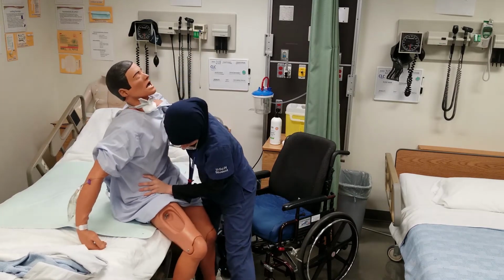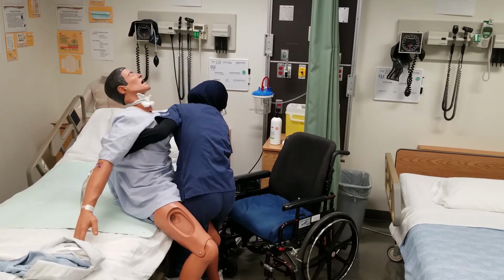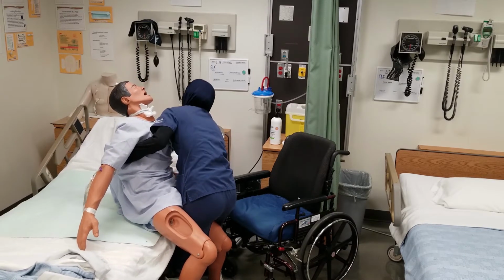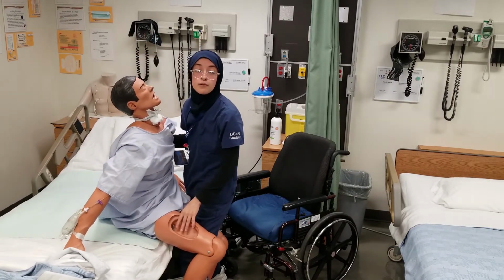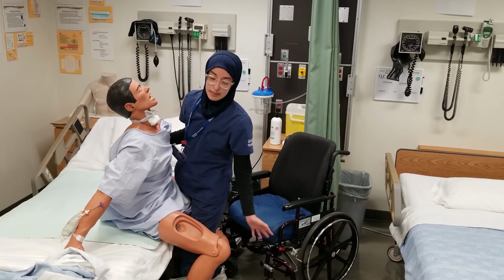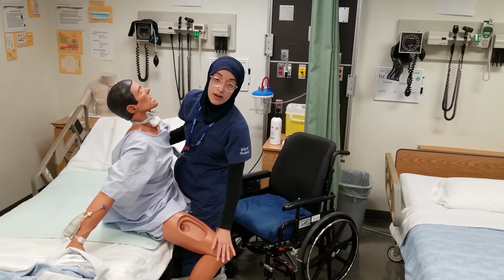Alrighty. So my patient is sitting. I'm going to lower the level of the bed so that the patient's feet are touching the floor. And then I'm going to place my non-skid footwear after I've made sure that the patient is not dizzy and they're not going to fall over. So again, because I'm holding the mannequin, I'm not going to do that, but I would place it on the left foot specifically because they have the cast which has non-skid on the bottom.